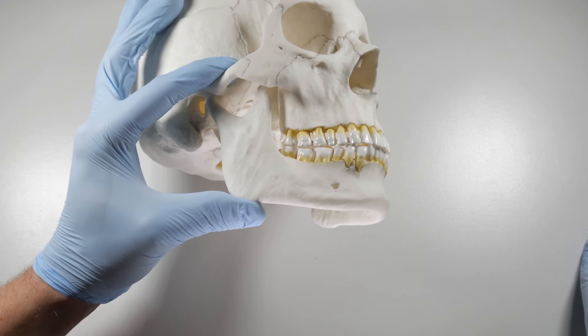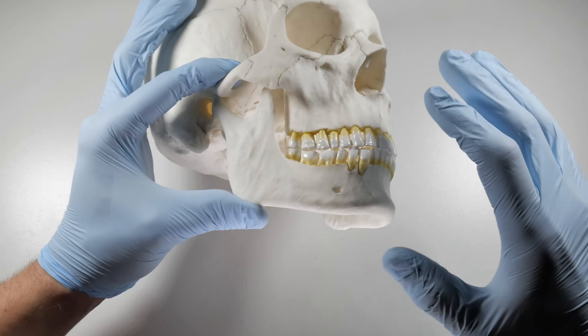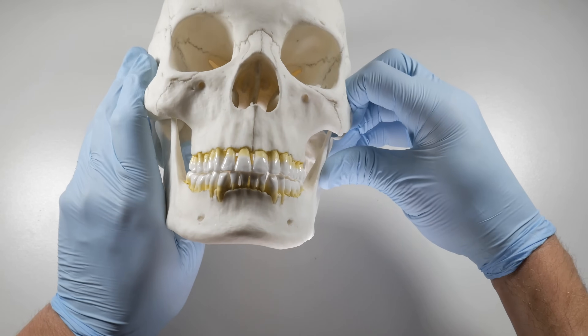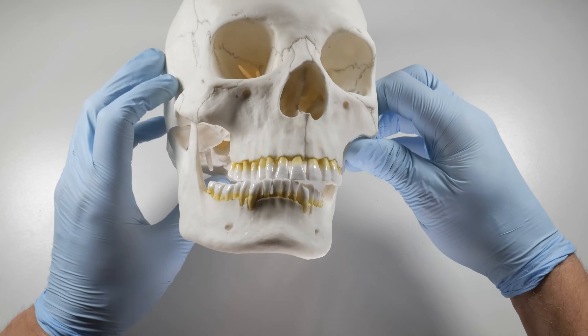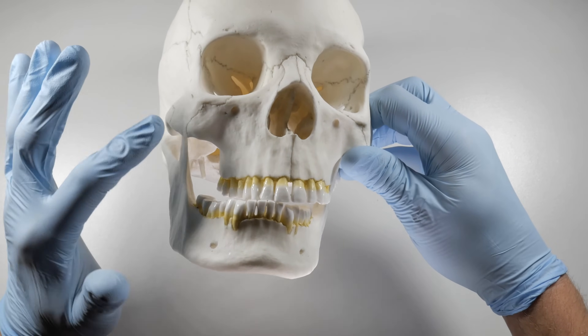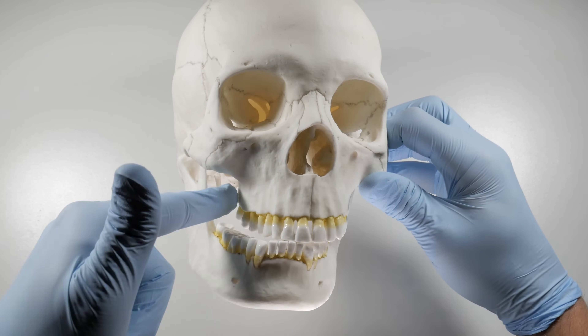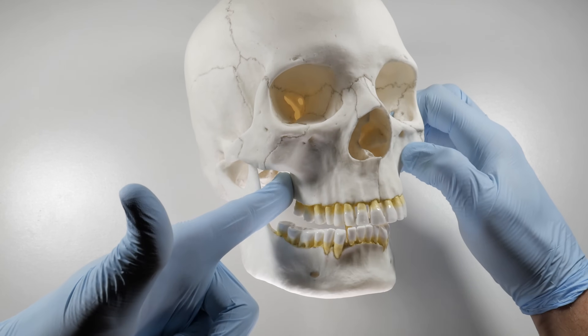In order to access this position, it can be difficult in some patients depending on how their jaw is shaped. You are going to have them shift their jaw to the side that you're injecting on. This is quite extreme in demonstration, but it gives you an idea — what it does is move the ramus and the coronoid out of the way, so you can get much better access to this area.